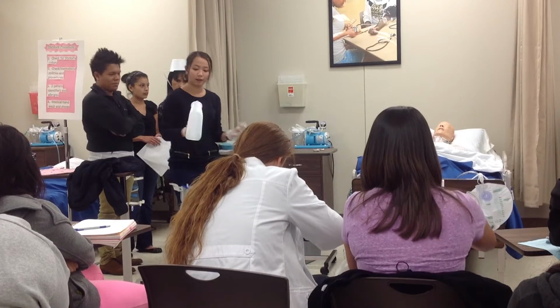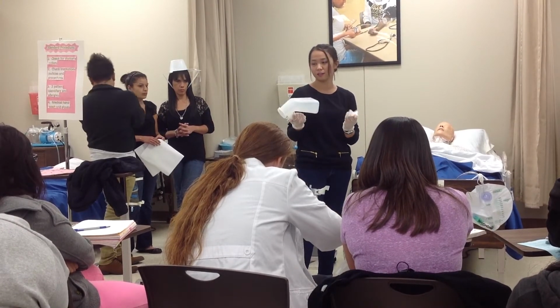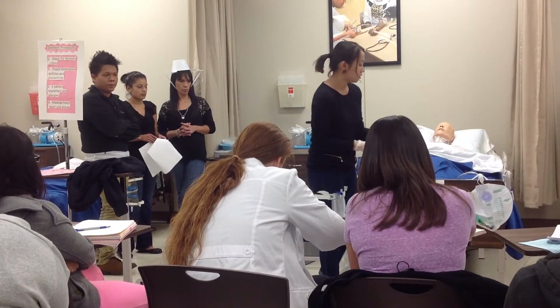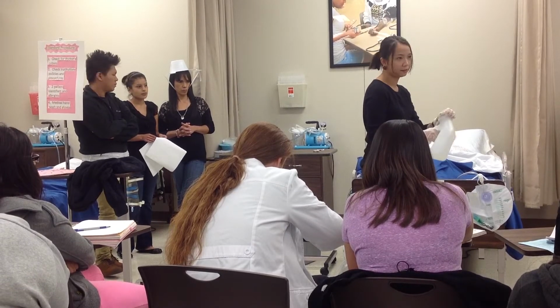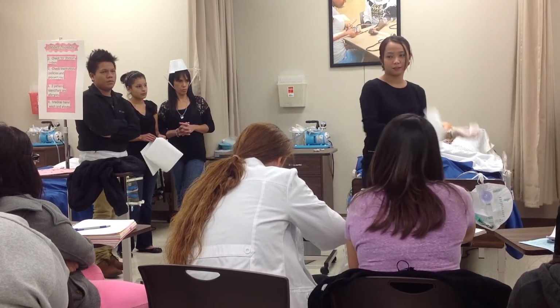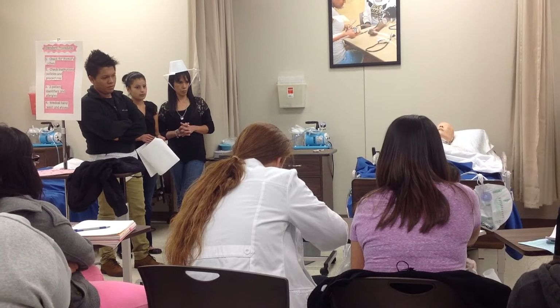So you're going to have your urinal. You can use a graduate or a hat. It's easier if you have a urinal like this because it has a handle. You have your alcohol swab or pad ready because you don't want to reach into your pockets after you've touched the valve and emptied the catheter. So you just go ahead and open that one.